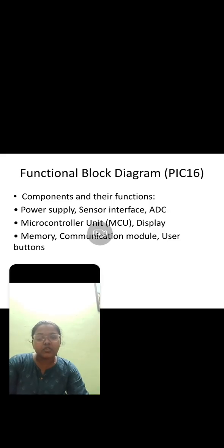That is known as user buttons. To know about all these errors, we have user buttons. It is helpful so that even a simple user can use this device. Not only a medical professional, even a normal person can use it. For that sake, we have user buttons to explain everything: the errors, how to use the device, and whether the blood glucose range is in the diabetic or pre-diabetic stage. Even if they don't know, the user buttons explain it, so it's not a big thing.